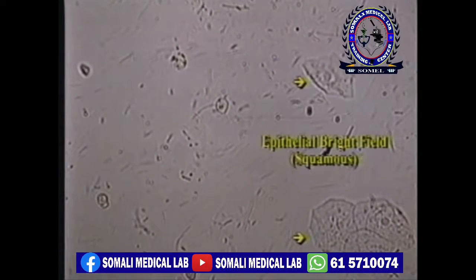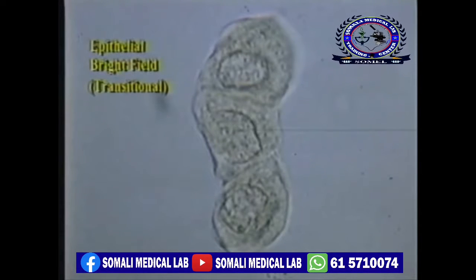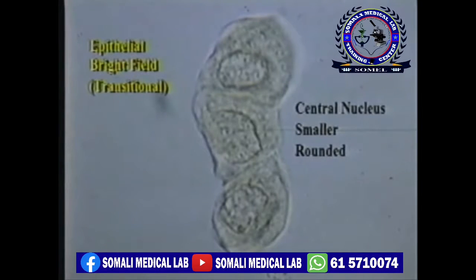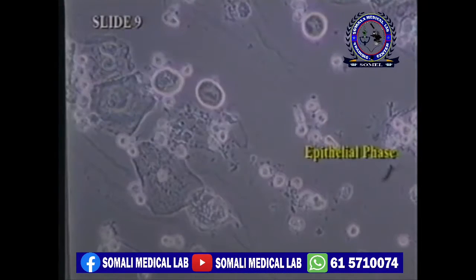This is what squamous epithelial cells look like on bright field. The second type of epithelial cell that should be differentiated is the transitional epithelial cell. Transitional cells have a more central nucleus and are smaller and more rounded than squamous cells. This slide is bright field under high power. This phase view shows what they look like in combination.